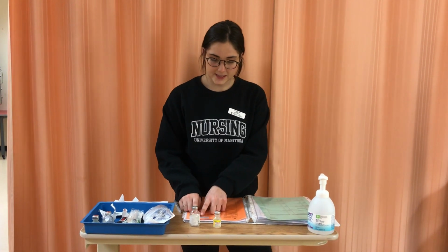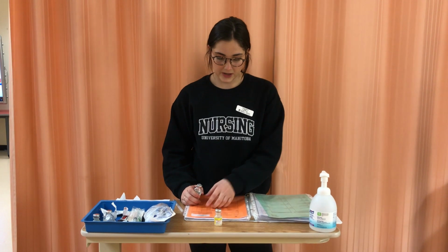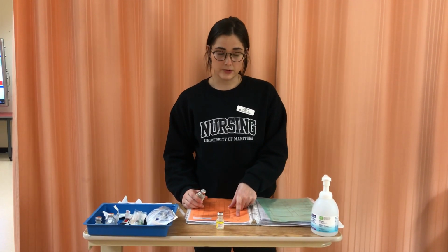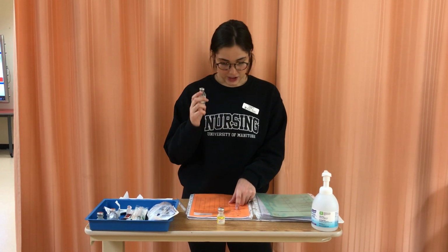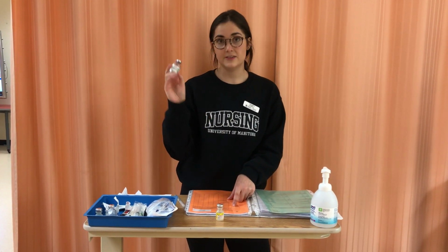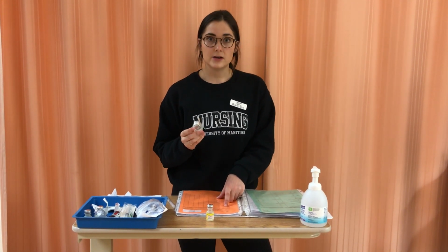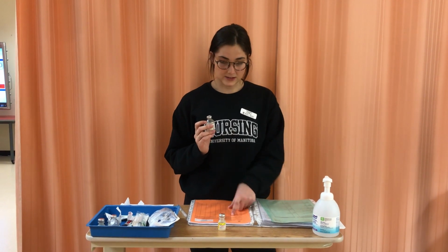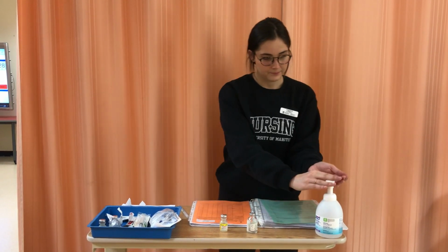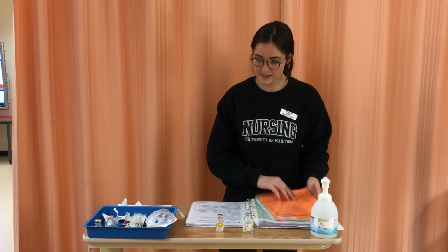So we have Frida Fritz here. She was admitted to the hospital with cellulitis, so we're going to be giving her Penicillin G. She has no known allergies. So we're going to do our first check, Penicillin G. Penicillin G Sodium, 3 million units. This is a 5 million unit vial. It's supposed to be given IV route. We're going to give this IV, and it's every 4 hours, and it has not been given yet, so the time is now. So we're also going to check the parenteral drug monograph for Penicillin G.